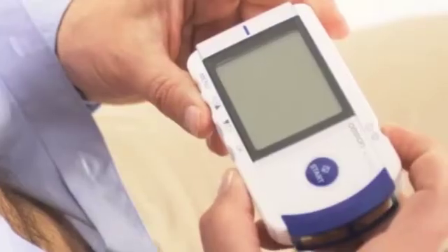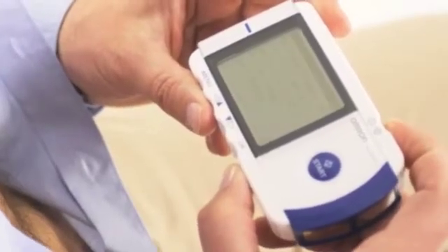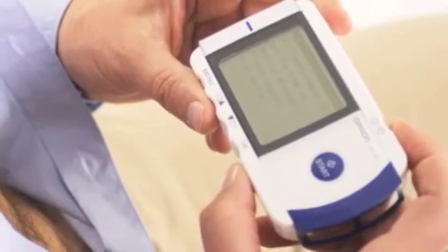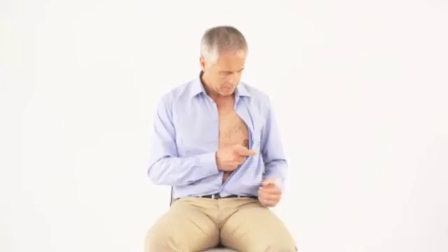Press the on/off button to turn the monitor on. Place a finger close to the two finger electrodes on the right side of the monitor. Place the chest electrode directly onto bare skin approximately five centimeters below the left nipple. You don't need contact gel.